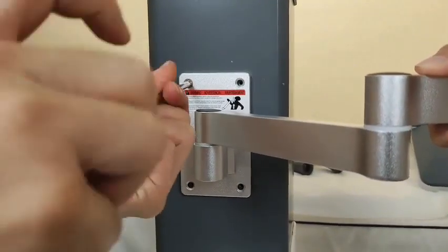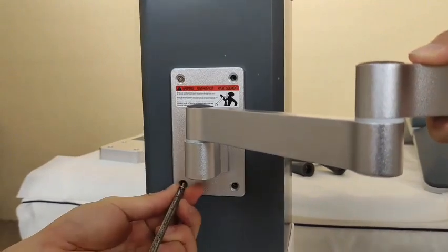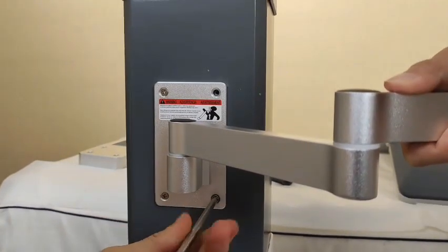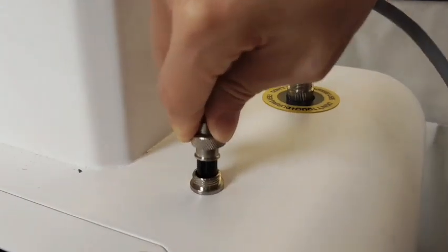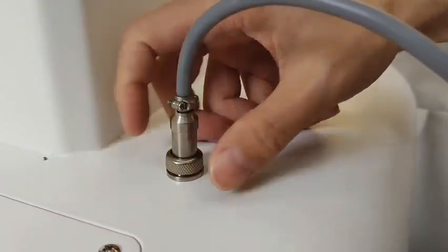First step, we will install the screen. We need to match the holes and then use the screws to tie it. Next step, we will need to install the tilt of the screen.